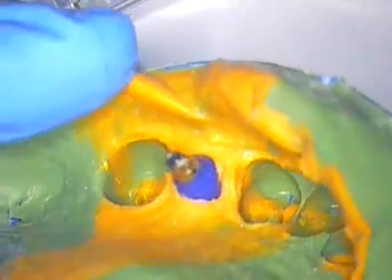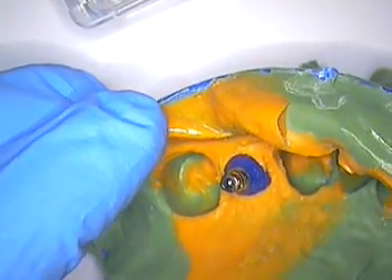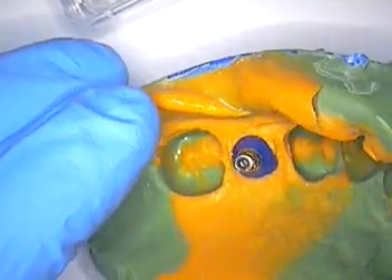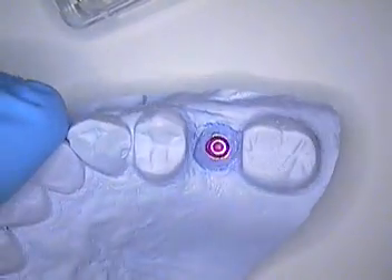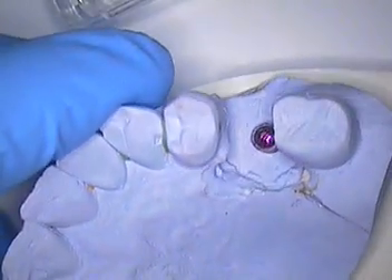Let's go to the model work. Of course, it's an open tray impression, like most of our impressions are. I've pretty much discontinued closed tray impressions unless it's a very difficult impression to take. Number two, here's the stone model that we have poured — I'll get into talking about this in a minute. And then, of course, the soft tissue model.